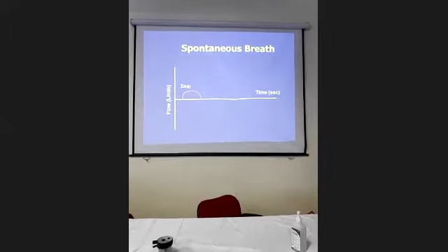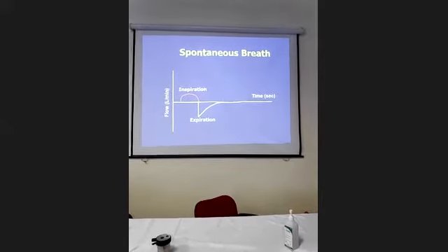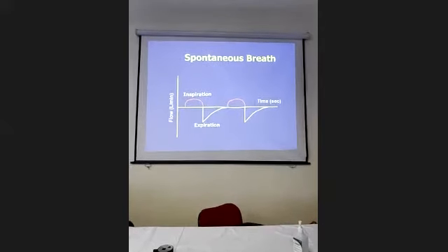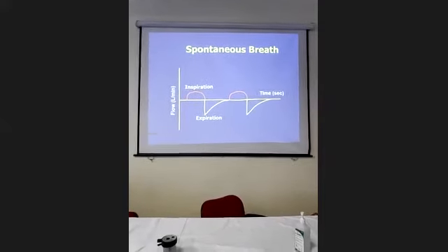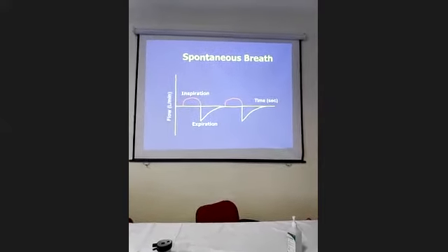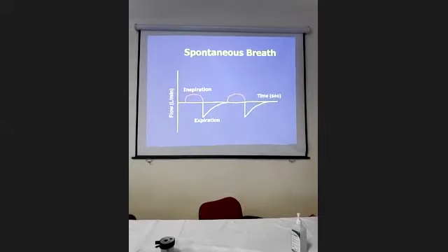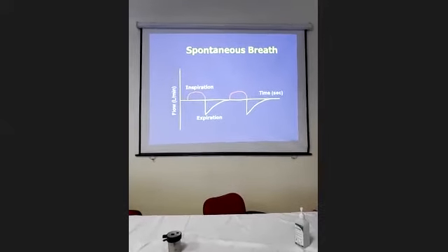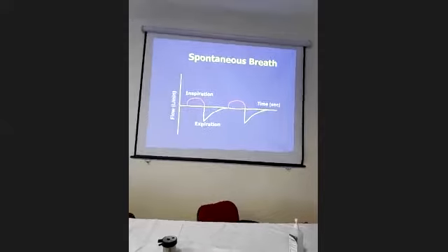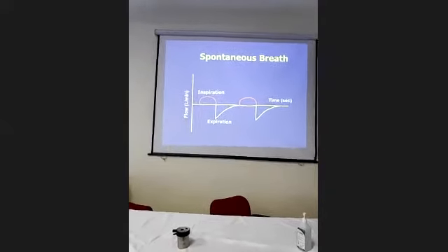But I'm telling you, I'll tell you one by one. We'll go from the simplest part, spontaneous breath, and finally to the high end of mechanical breath, how we give it. So first of all, you see how this graphical representation comes when we give a breath in a spontaneous mode. So this is a spontaneous breath. That means the patient is breathing on their own, and you have connected the ventilator, and you look at the graph which is coming on, and this is a scalar flow time graph.